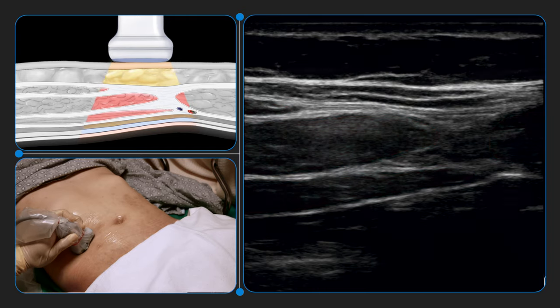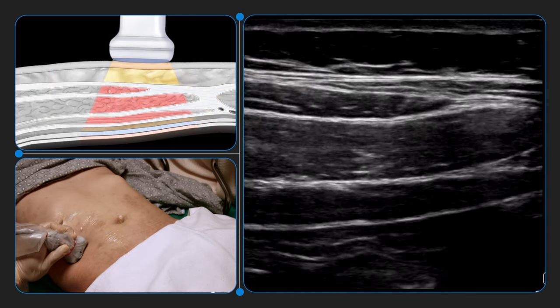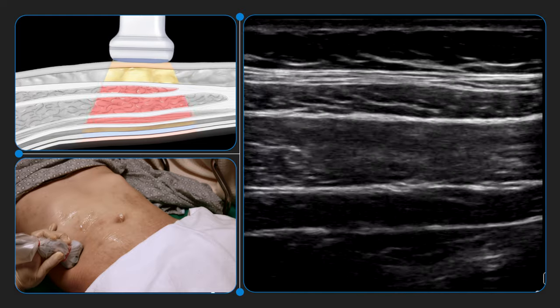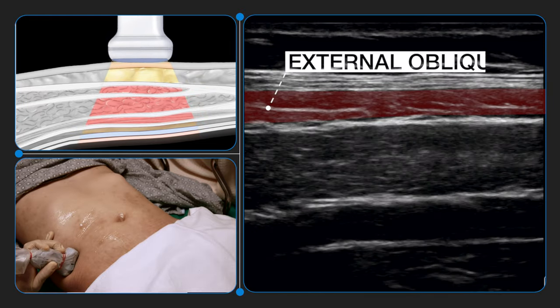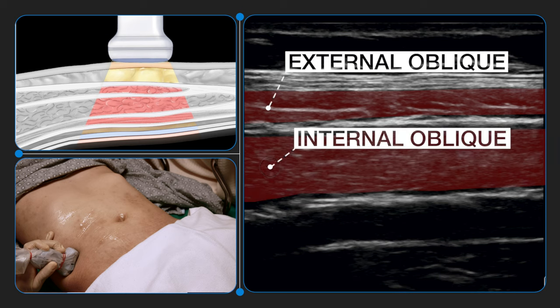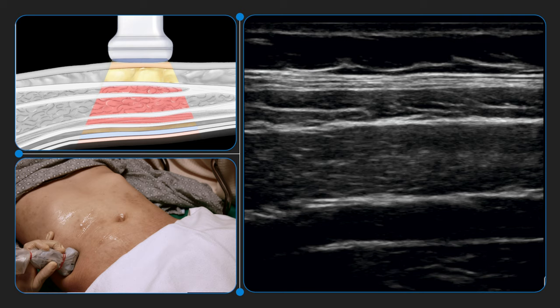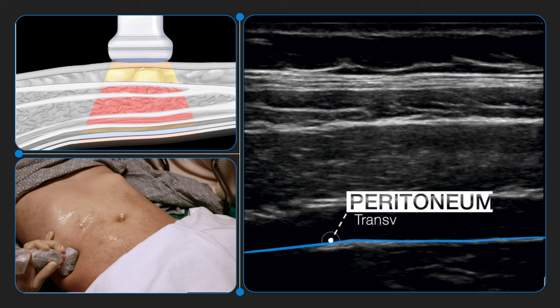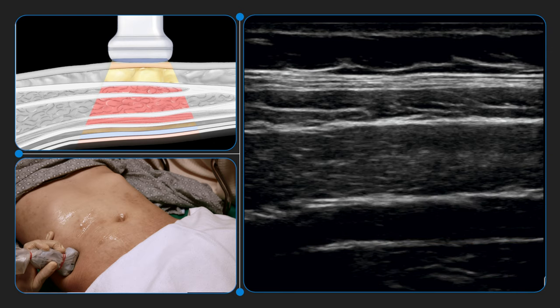From this relationship, the three relevant layers are easily identified and tracked as the transducer is translated laterally. The target is clearly seen as the neurovascular fascial plane superficial to the transversus abdominis muscle. The peritoneum and contiguous transversalis fascia are also safely identified as a hyperechoic structure deep to the transversus abdominis muscle.